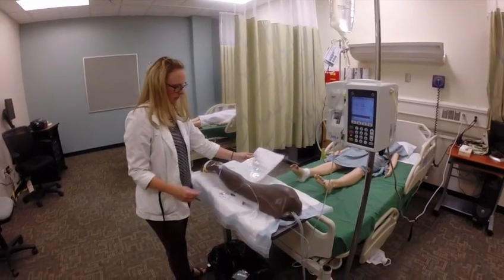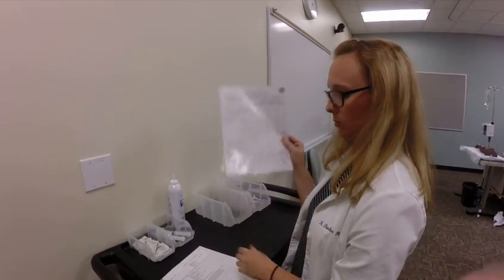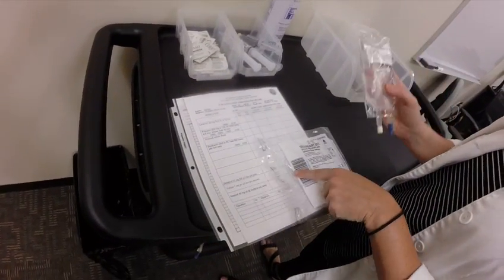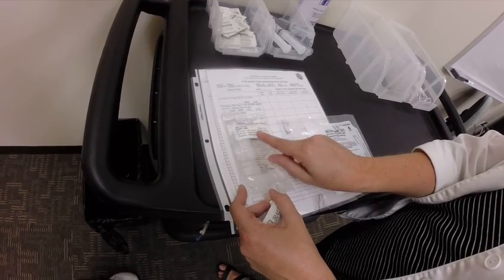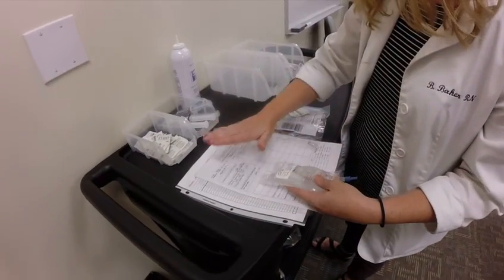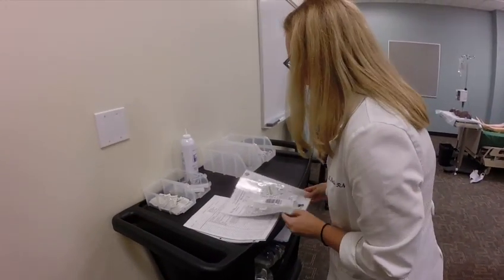So Mr. Smith has his primary fluid. I'm going to go back to patient B, Ms. or Mr. Imahurt. Again, checking my order with the MAR — everything matches. For this one I need my secondary Plum set, my medication, and some alcohol. I'm going to do my three checks with my medication. I'm giving Primaxin 500 milligrams in 100 mils over 30 minutes. Primaxin 500, 100 mils over 30 minutes. My bag says Imahurt, matches my MAR. I've got my supplies. Before I go in the room, let me check one more time — doing my second check. I'm also changing patients, so I'm going to sanitize my hands.